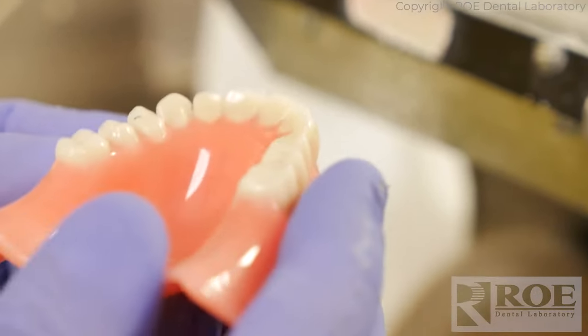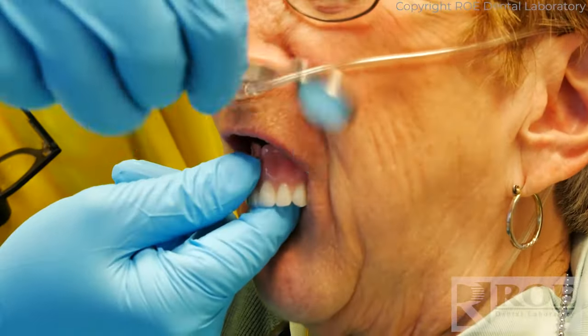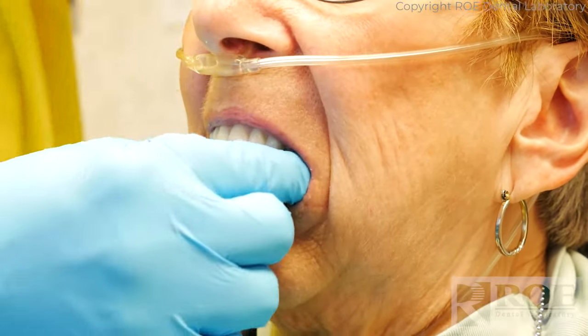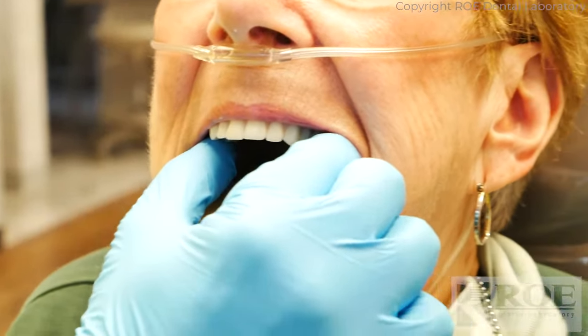I think we're good. Your gums have been used to what they've been used to for some time. So when these are placed, it'll take a minute for the gums to slightly adapt — you might feel it's not as tight as you thought. Give it a minute, give it a week, and see if it gets better. You've got those two different bites — you can go in the back and you can go forward. But you were hitting in the front a little hard, so I relieved that front area. You might need to be relieved even more next time. You're done — I need a big smile so I can see that. Beautiful.